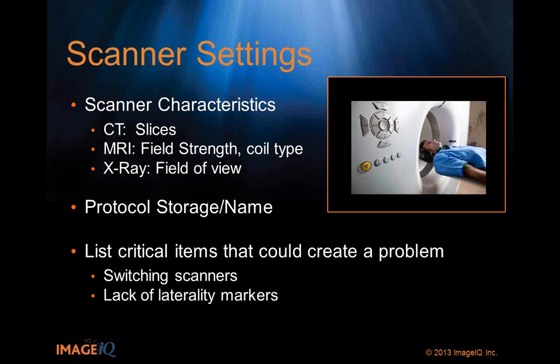Whether software markers or they need to go old school and get their lead back out, either is fine, but document that lead markers are required. In some cases we have seen this happen, and explaining it really hits it home with the technologist: I need to do this and this is why. That really helps adherence to the protocol.